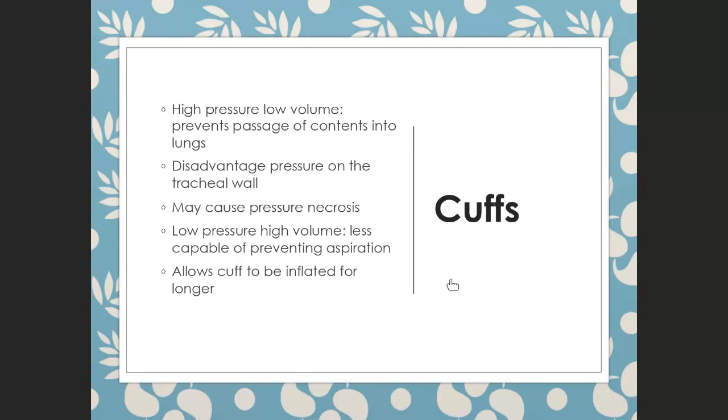Cuffs, we really want them to be low pressure, high volume, because that makes it not put so much pressure on the tracheal mucosa.